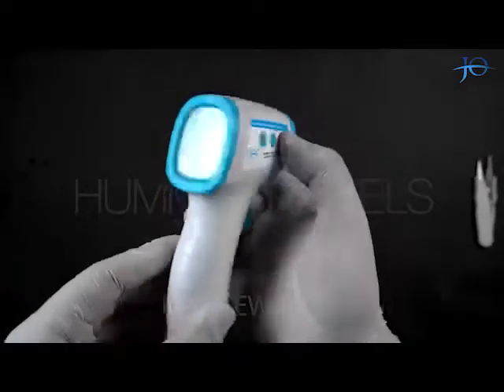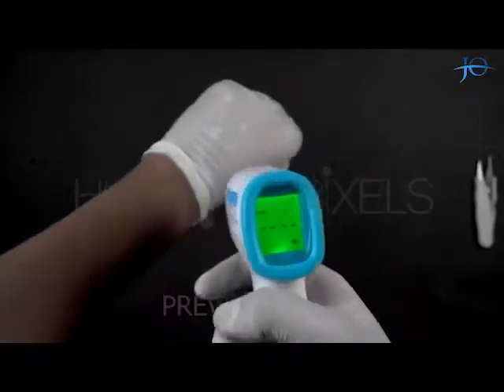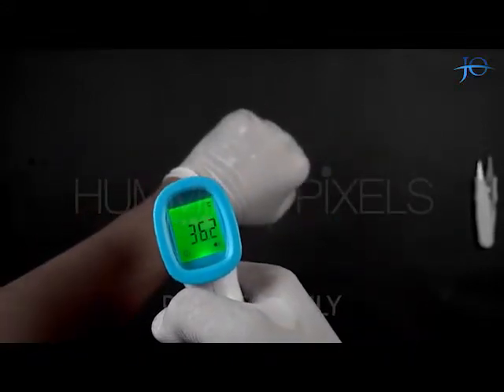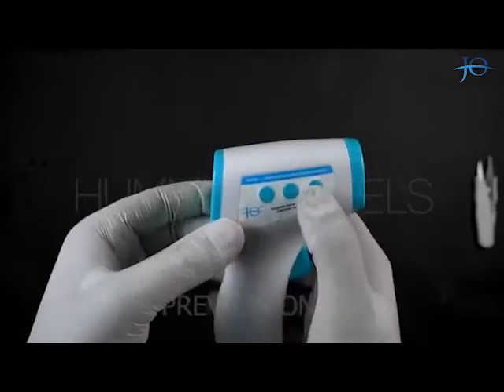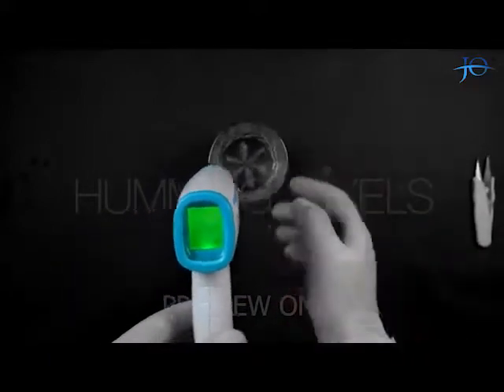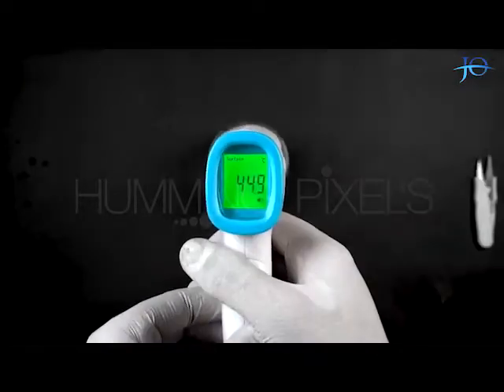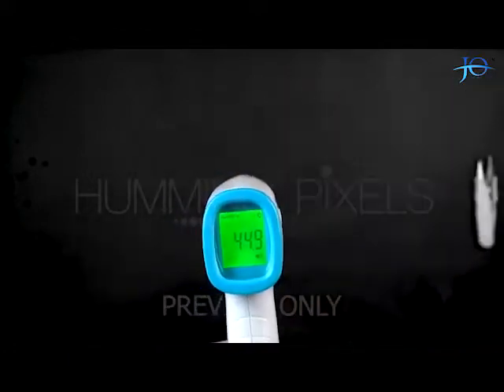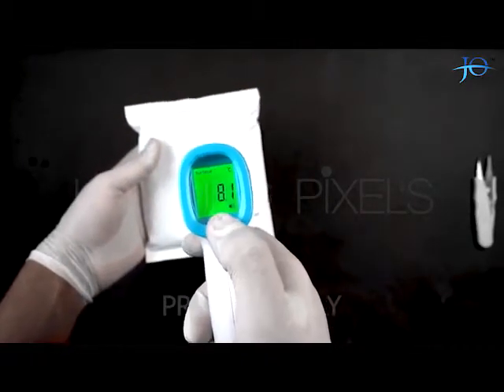By pressing the Mode button we can choose between body mode and surface mode. When we press the trigger button, we can see that the screen is now indicating the temperature of that surface. Now let's try it again with a pack of ice and repeat the same process. As you can see, the reading of the cold surface on our screen is 8.1 degrees Celsius.